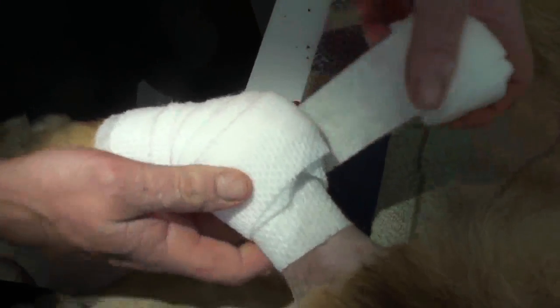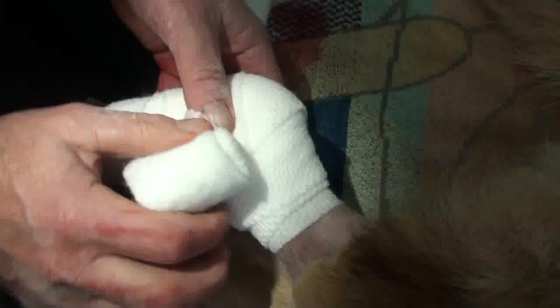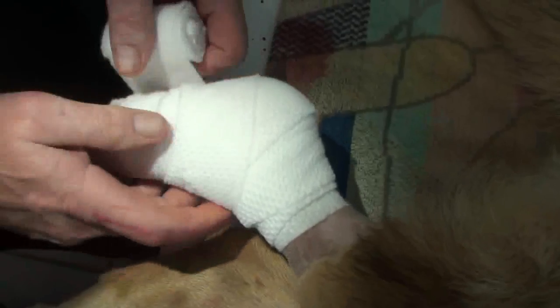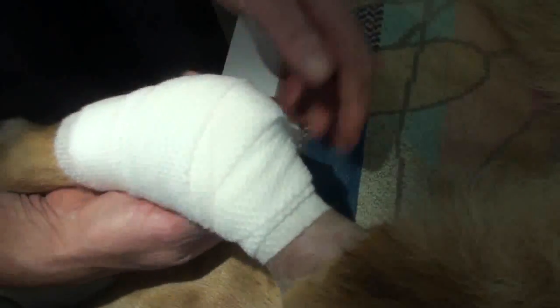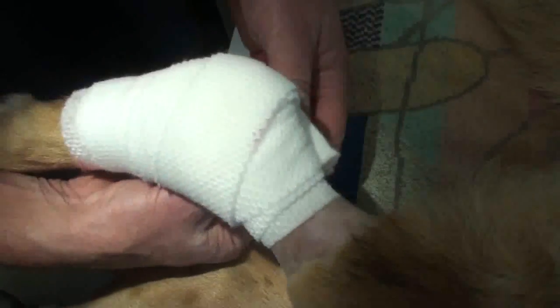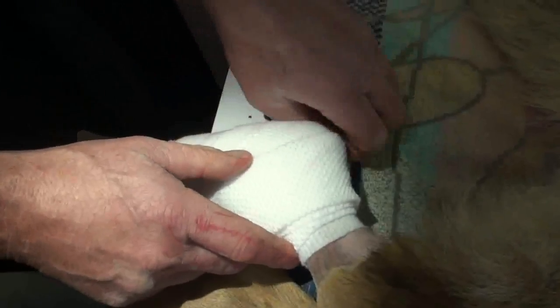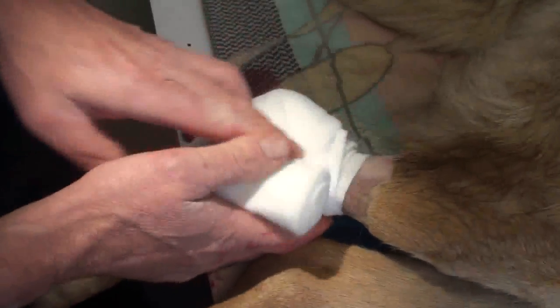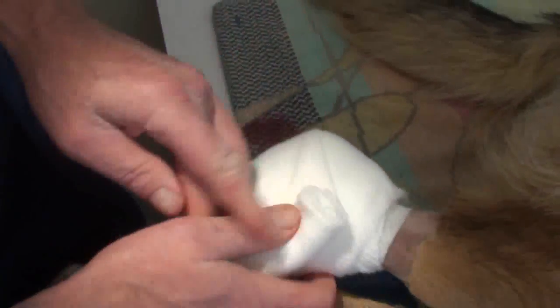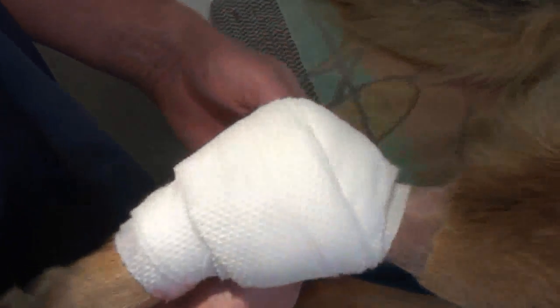That's another good reason. We're also immobilizing the joint, and we're padding the outside where Jaeger is going to hit this hock — we're going to put a bunch of this padding on. We overdo it for these legs. This is going to be really padded; in this case with the point of the hock there, you need a whole bunch of bandage. Now that's pretty padded — if he bangs it, at least it won't be so bad.